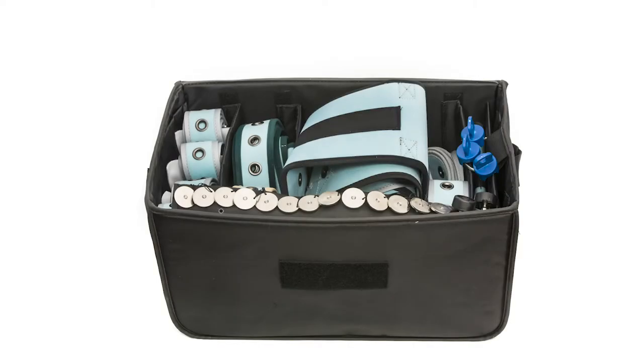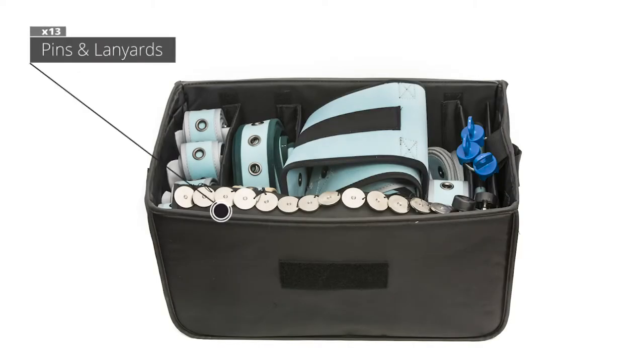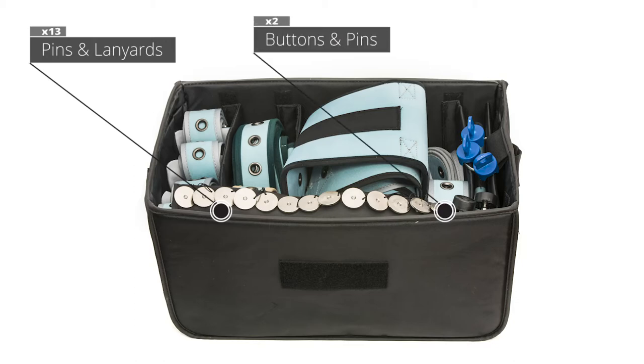The front of the bag contains holes that hold 13 buttons, pins, and lanyards, and two buttons and pins only. The right side of the bag has a metal ring holding three magnetic keys.